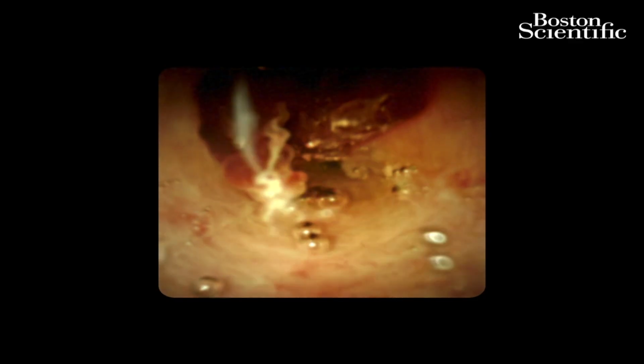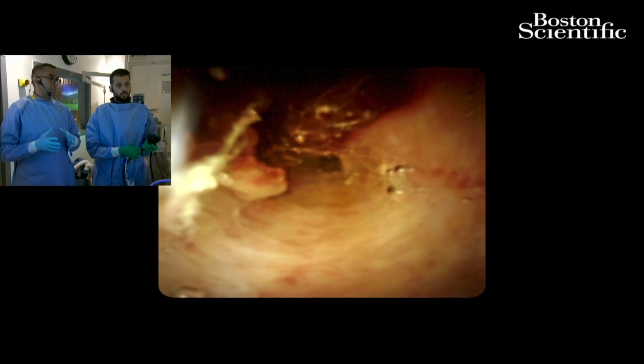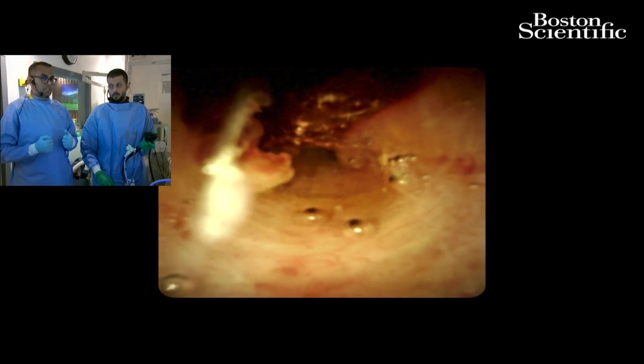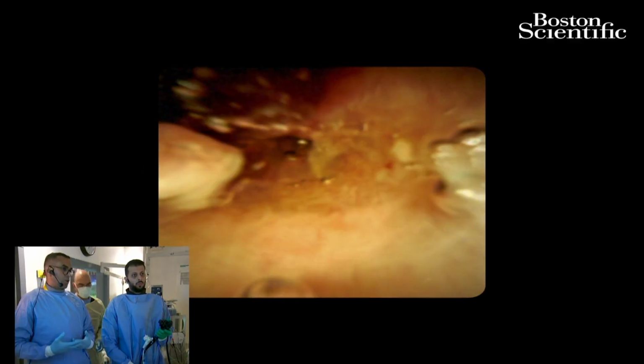Cholangioscope, if you suspect that kind of lesion, I myself prefer to go with the index ERCP spyglass, because the more you intervene, the more you place stents, especially plastic or metallic, that can create compression damage and trauma to the tissue. Therefore, when you take biopsies from the lesion, they can show only atypical cells, which cannot diagnose the patient.